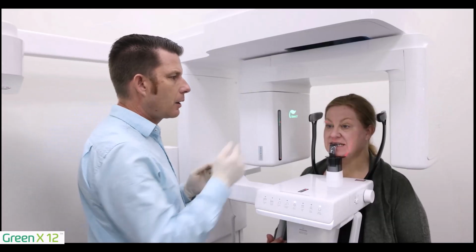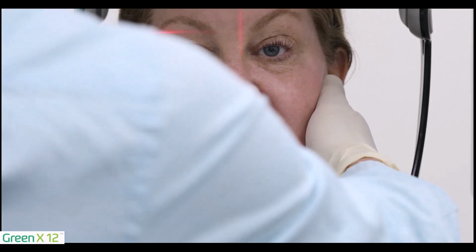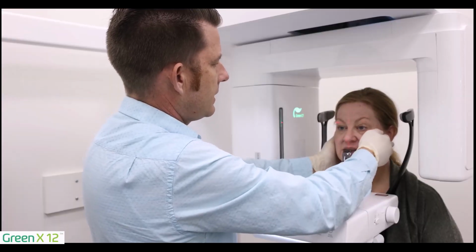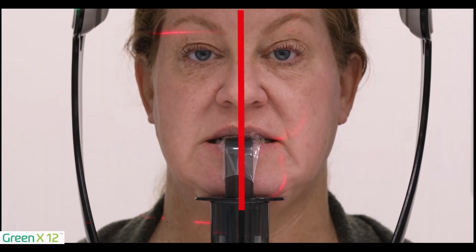So first I want to start with my mid-sagittal beam, and I'm going to go ahead and have the patient gently open and gently close on the bite stick. We're going to get you there. Perfect. I have my patient right on the bite stick. I can see my mid-sagittal beam right between the eyes and right through the philtrum.